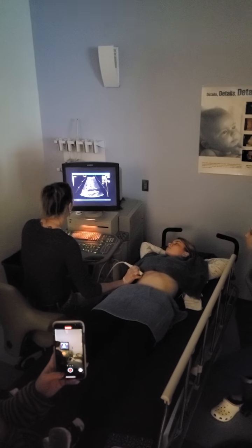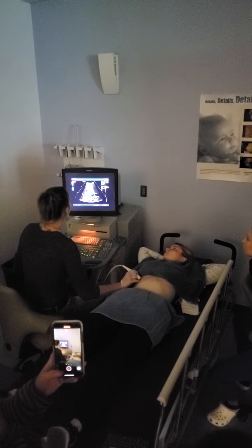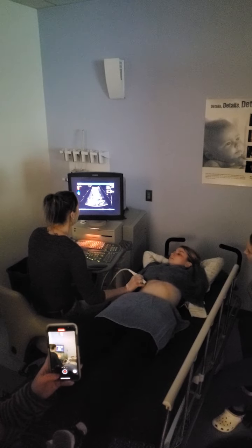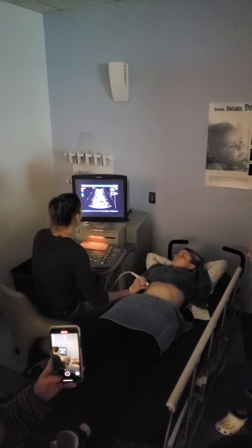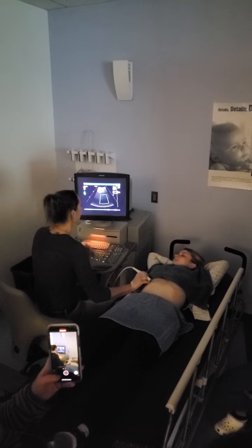So we're going to start with our color. What I usually do is get all my settings ready to go. So my velocity is looking good, and then I just say, patient, go ahead and hold your breath right where it's at. I don't want a big breath in, so actually try big breath in and hold it. So I get my spot, and I'm like, what happened? Go ahead and breathe out.